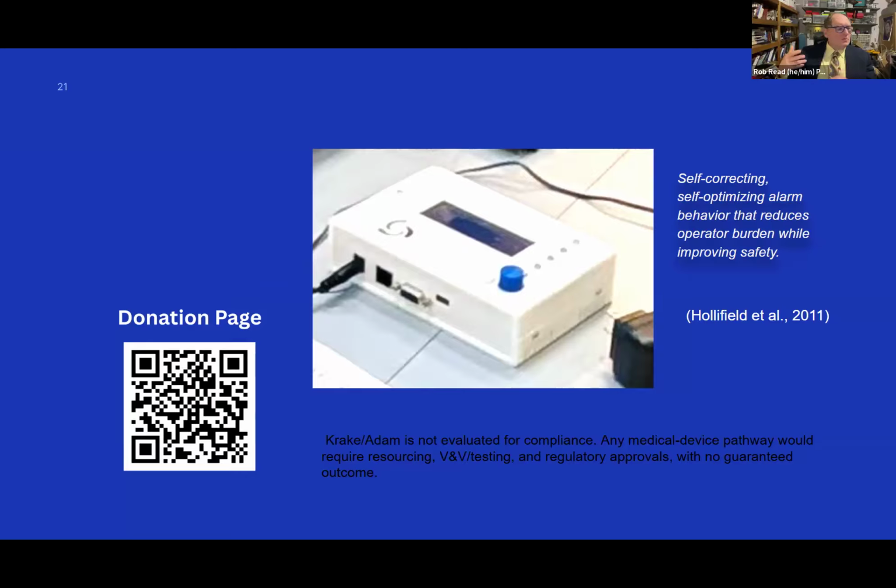I don't know for sure if we're going to keep making the Polyvent, or if it is ever going to be used. But if it grows into a device which is made by a firm, which probably won't be Public Invention, and sold as a medical device used to keep human beings alive, it has to have an alarm system. We're building an alarm system, but of course, we're also making it so it can be used on other devices. And Victoria has corrected me that transport vents have alarms. I'm sure in the pandemic some of them didn't, but yes, maybe that's true.